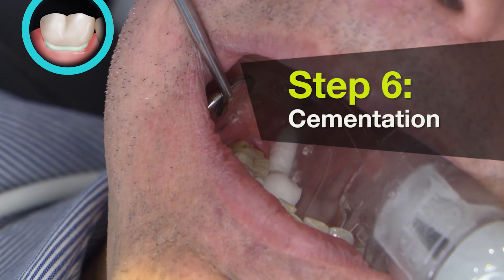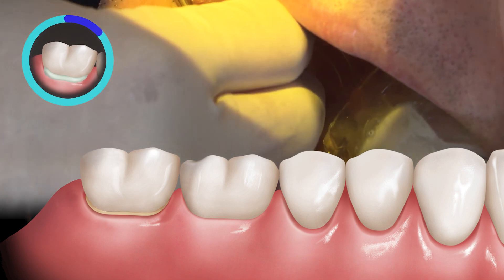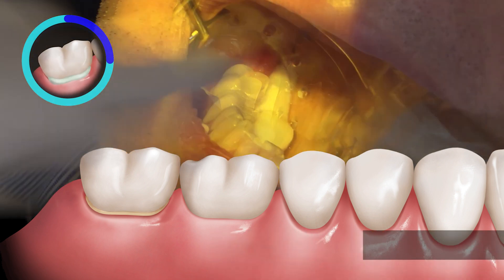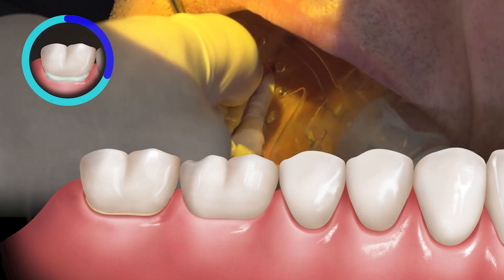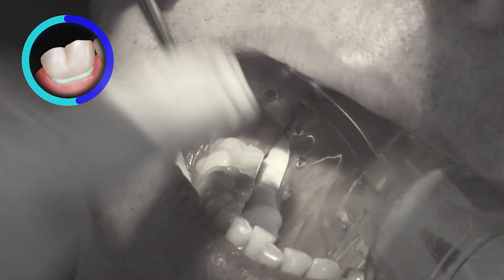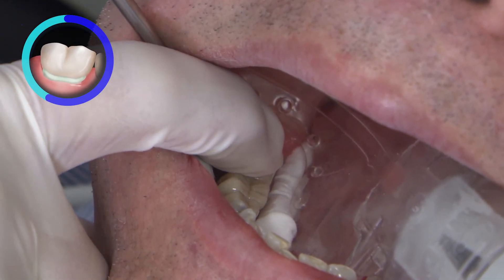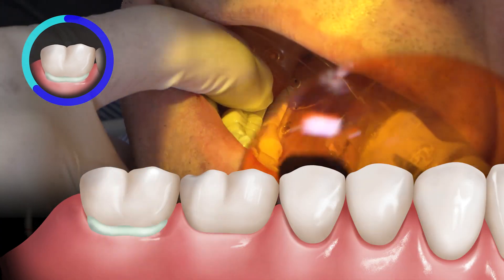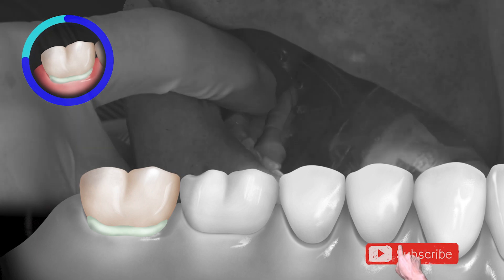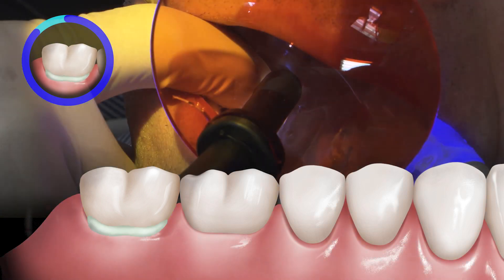So we've now filled the restoration with our adhesive resin cement, and we make sure we apply that down with good pressure. We've now seated our restoration with the Reliax Ultimate Adhesive Resin Cement. Then with our resin cement we will tack cure for a couple of seconds on each side — about two to three seconds. I would err on the side of less time at first, especially if you're new to a resin cement. You don't want to cure for too long.